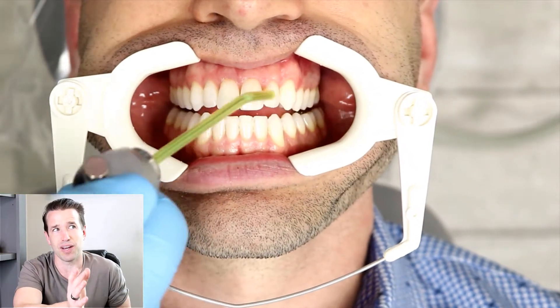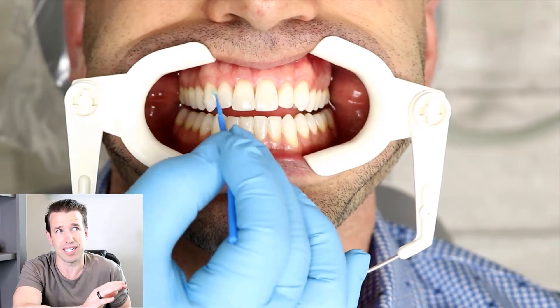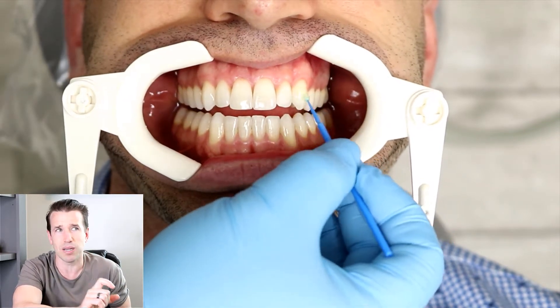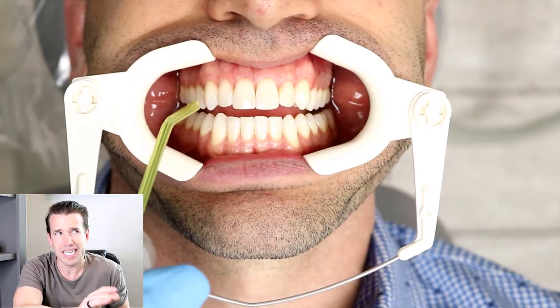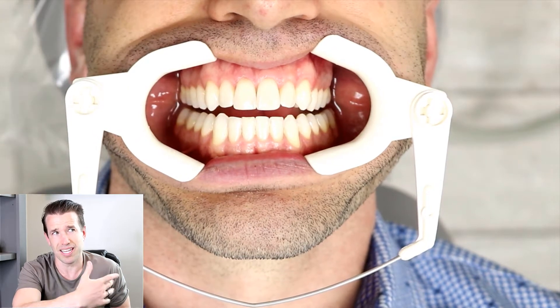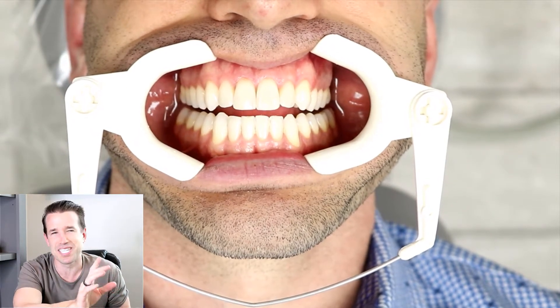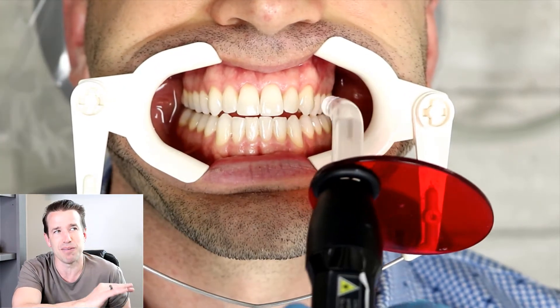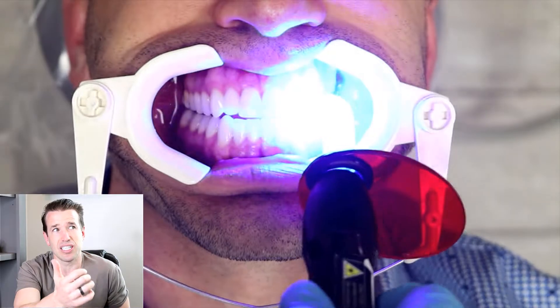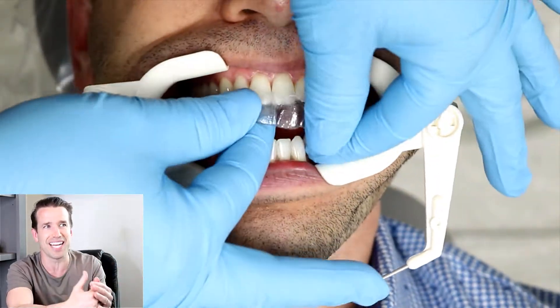She's etched it, she's taking away all the etch, and now she's air drying the teeth. You're going to see a frosty white appearance. After that is done, she puts on a little bit of bond. We put the bond on and then air dry it, so it's a nice thin layer. I actually remember the smell of this and it smelled pretty good. She puts on the bond, makes a thin layer, then she cures it with a curing light — it's very similar to what you'll see at a nail salon, that blue light.